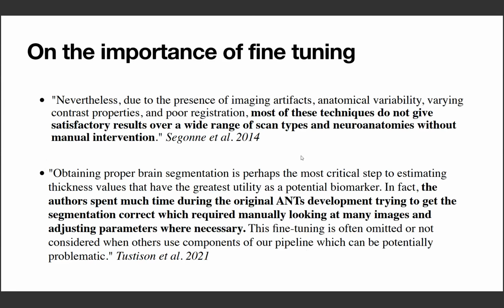Finally, on the importance of fine-tuning, these are two papers. The first paper is a citation from FreeSurfer as well, where they talk about how it's hard to do things without manual intervention. And I think Farouk will talk more about that. Some cases are just so special that maybe doing things automatically is not the way to go. And also other package developers have already pointed out that when you're trying to do this segmentation, the authors usually do look at these images and go through this fine-tuning.